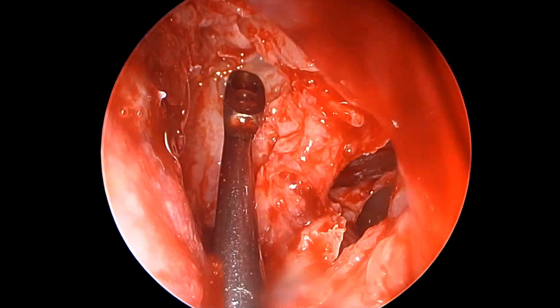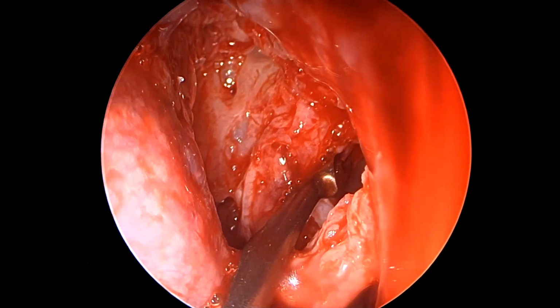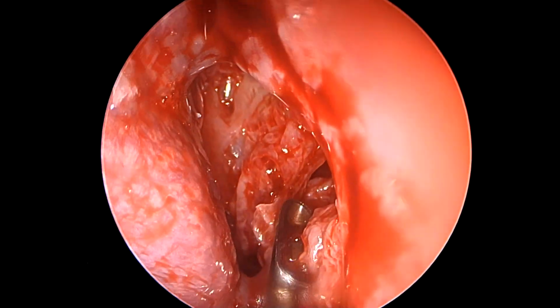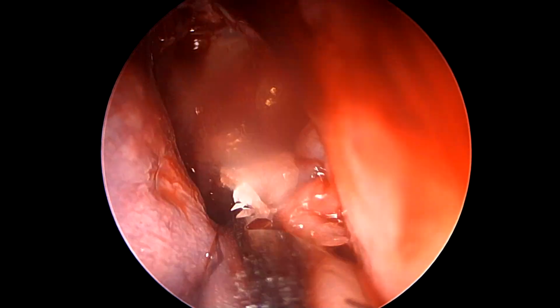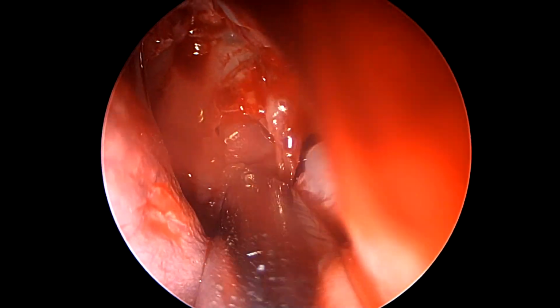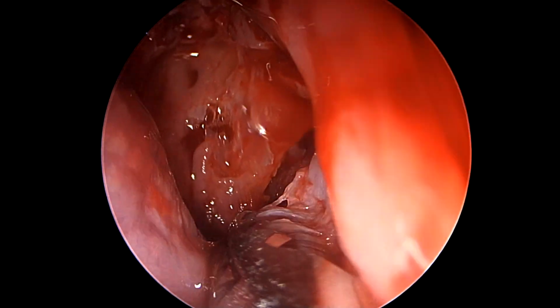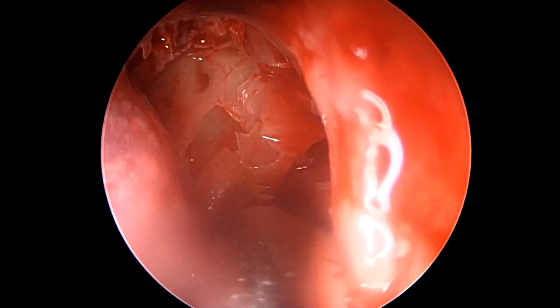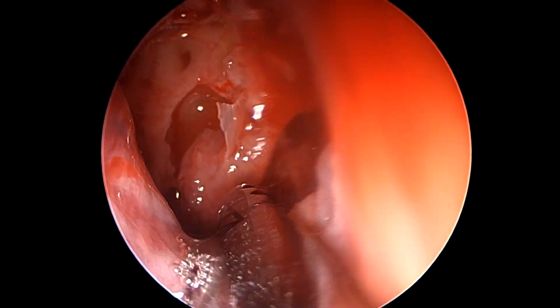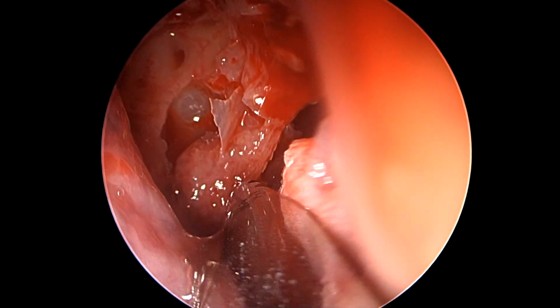So as we go here, even on this side, we are trying to remove some cells superiorly in the area of the frontal recess, though we have not really approached the frontal recess per se. So here we use a shaver blade again to have a reasonably large antrostomy, which helps us gain perspective of the height of the sphenoid and the level of the posterior ethmoids, so that we keep our overall 3D perspective in check while doing sinus surgeries in such kinds of anatomies.